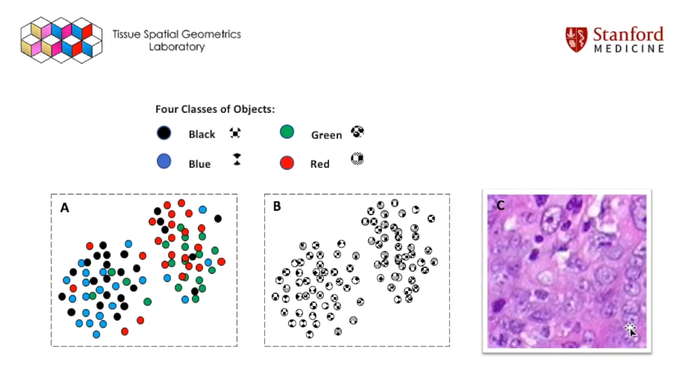If you look at panel C, here is an H&E image of a breast tumor. And you can see that there are distinct nuclei based on their chromatin patterns, right? And so the pathologist can see that there are recurring types of chromatin patterns that appear in this tumor image, but it's very hard for the pathologist to see and keep track of who likes to aggregate with whom. Thus, I developed the numericized histogram score to solve this problem.